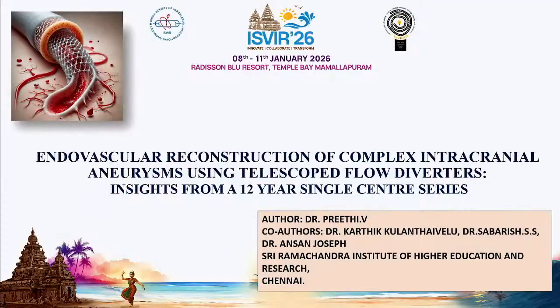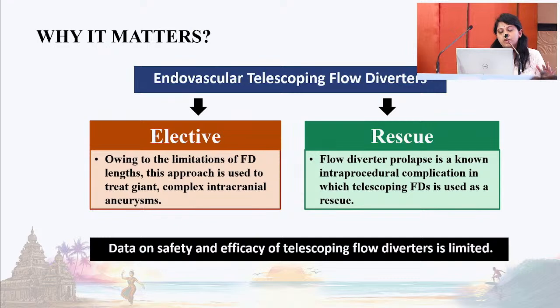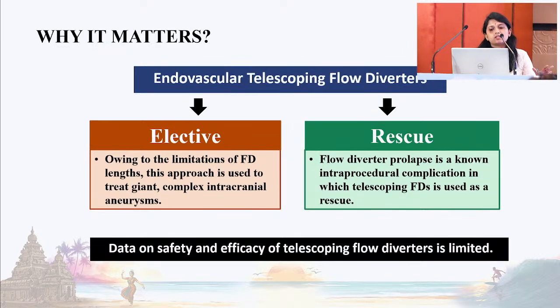Good morning. I am Dr. Preeti from Sri Ramachandra Institute of Higher Education and Research, presenting our 12-year single-center experience with telescopic flow diverters used for complex intracranial aneurysms. The real-world data on safety and efficacy of telescopic flow diverters is limited. We have two scenarios: planned elective telescoping, and rescue telescoping for intraprocedural complications such as flow diverter prolapse or slippage.